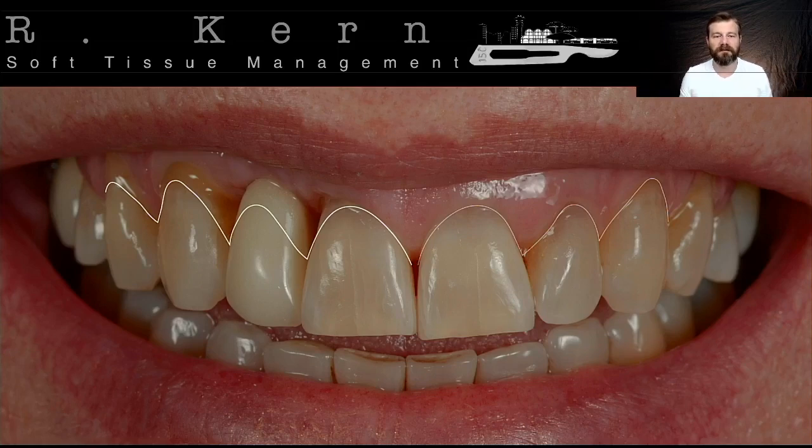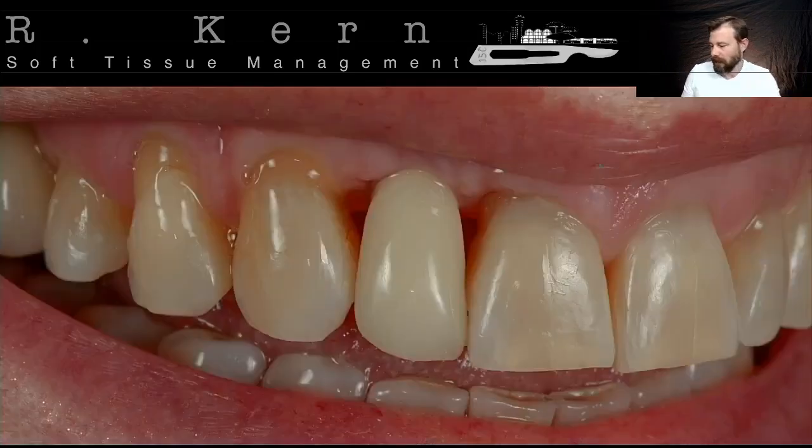Of course, the soft tissue deficiency here is evident. You see the difference from one side to the other. Not just talking about the retraction from premolar to canine, a little bit on the distal margin of the central incisor, but mainly the black space, on the papilla side, on the contour of this implant on the lateral incisor. And you see even the black space here on this area, the shadow area. We're going to try to really rebuild this for the patient.